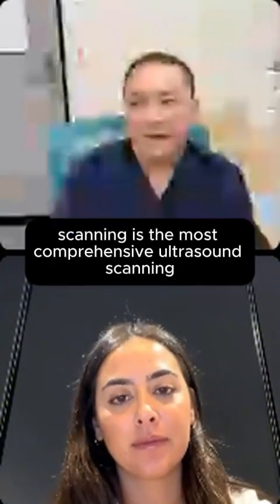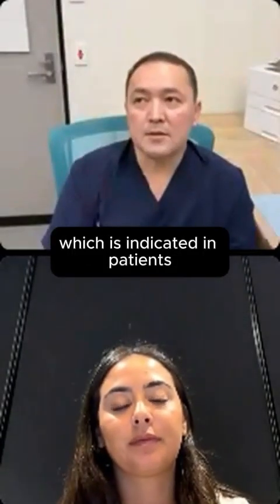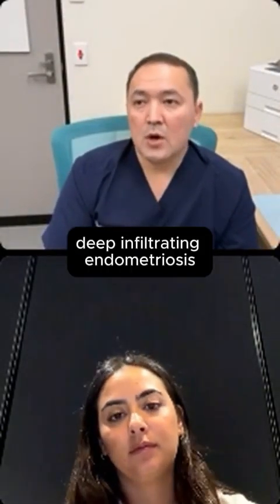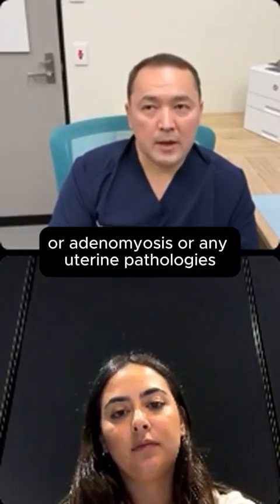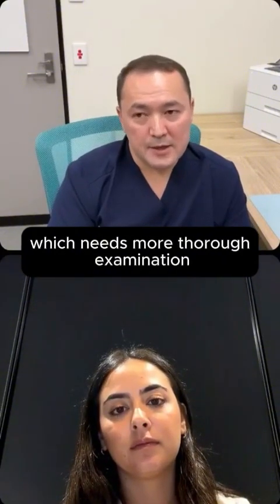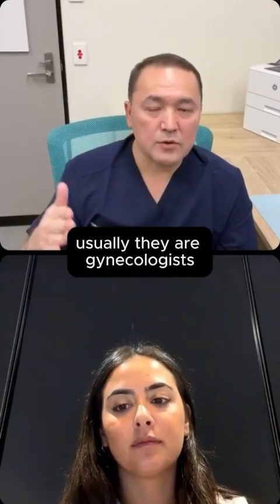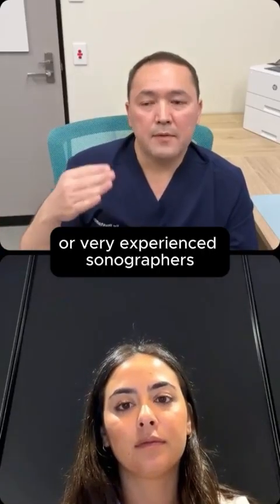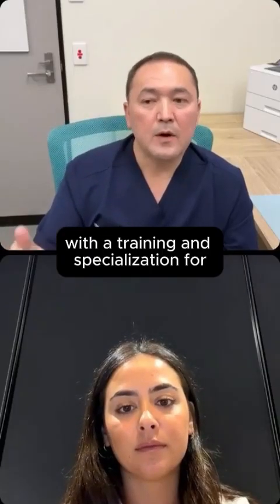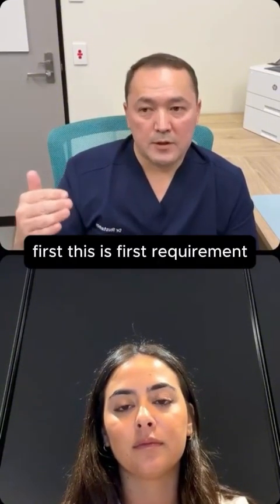Yes, so deep pelvic scanning is the most comprehensive ultrasound scanning, which is indicated in patients when we suspect there is deep infiltrating endometriosis or adenomyosis or any uterine pathologies like fibroids or endometrial polyps, which need more thorough examination. The difference in deep pelvic scanning, first, is that it's done by expert sonographers. Usually they are gynecologists or very experienced sonographers with training and specialization for endometriosis ultrasound scans and adenomyosis ultrasound scans. This is the first requirement.